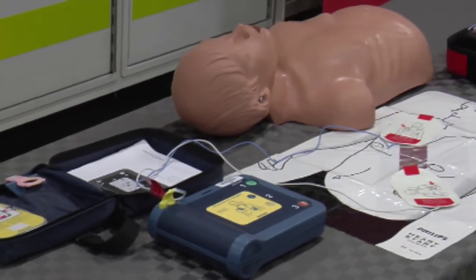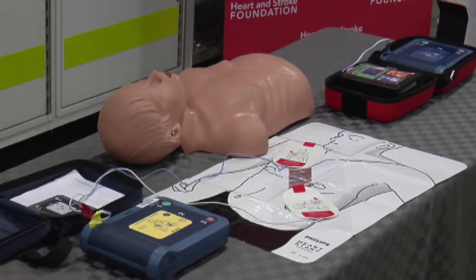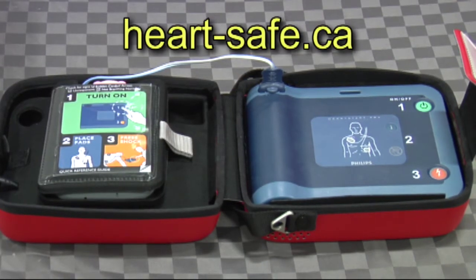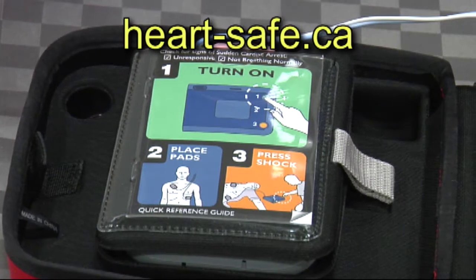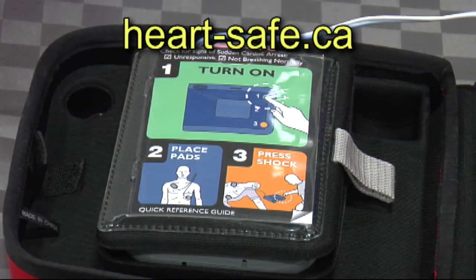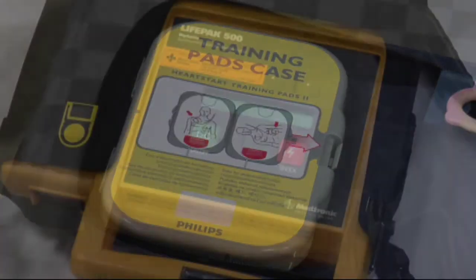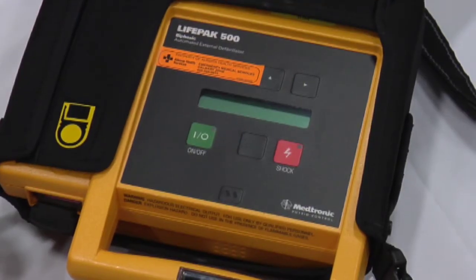Some of the times we know that AEDs are out there, but they're not being maintained in a regular fashion, and it has the risk of a battery going expired and dying, or the pads expiring or not even there. So our enthusiasm is to encourage communities to register their device with us at heart-safe.ca. We can then track that device. We can send them out an email reminder that their battery is about to expire or the pads are about to expire. And we ask that they do a monthly maintenance check on the device.